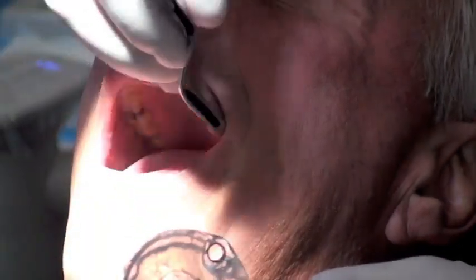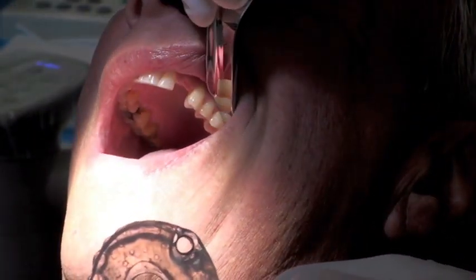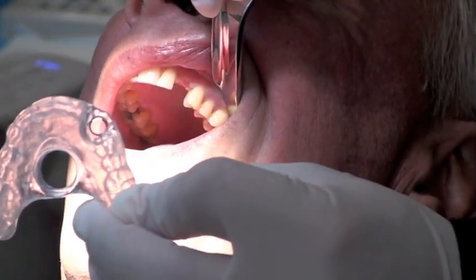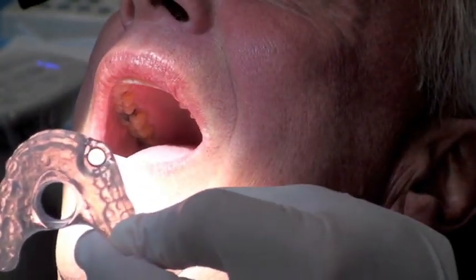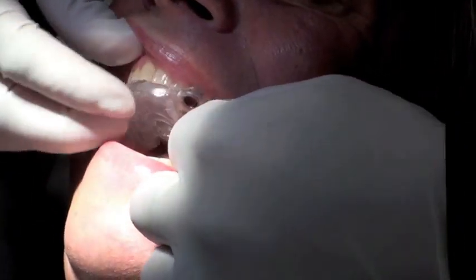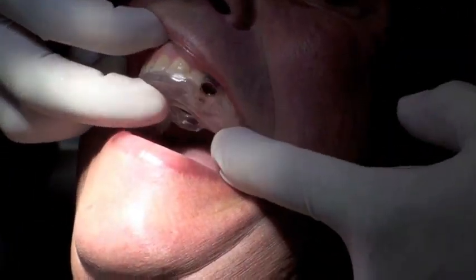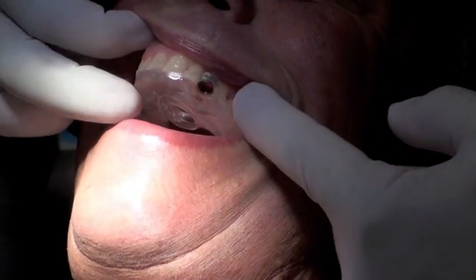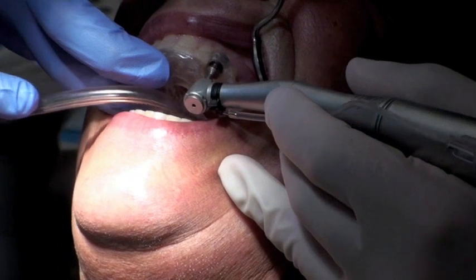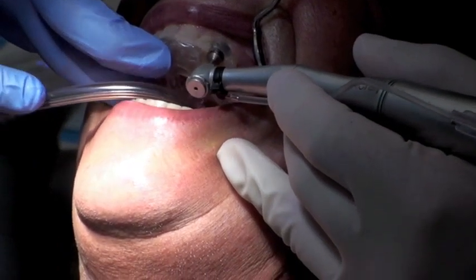At this point, we're just verifying the fit, and the beauty of this system is the snap fit that I've been able to get each and every time. You can observe that snap fit here momentarily. There we go. This patient has already been anesthetized. What we're doing at this point is a guided soft tissue punch.